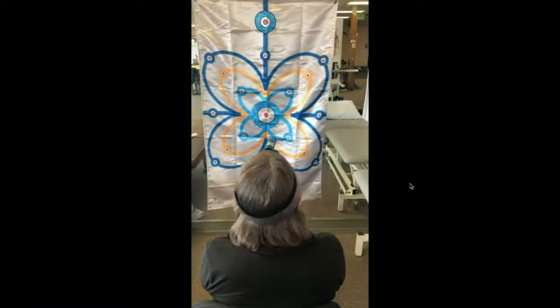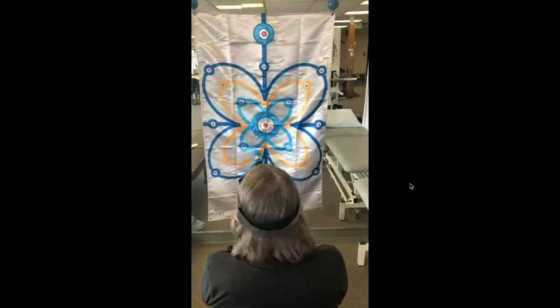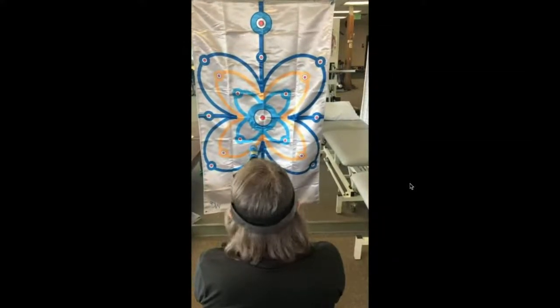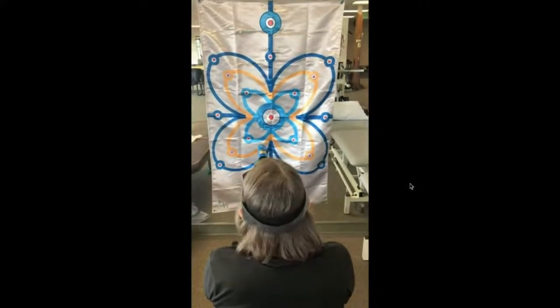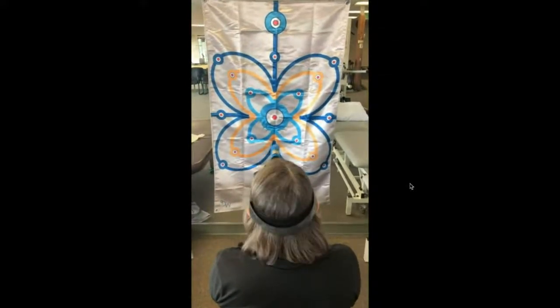Okay, so she's really irregular in her cadence, definitely irregular in her distance excursion from side to side. And she's got a lot of changes in the horizontal plane going up and down. So she's getting vertical at times, especially going toward the right. And she's just kind of all over the place.